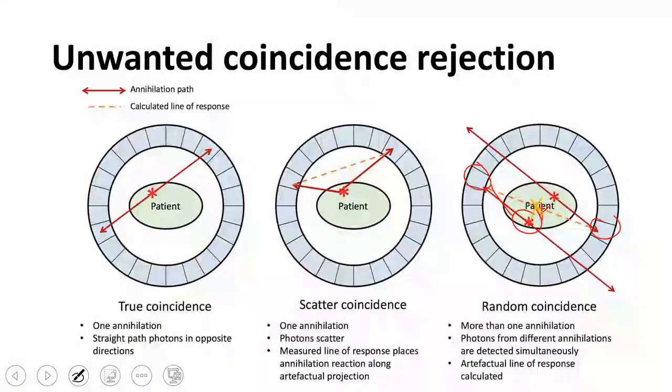The true event, which is the first one, is the true coincidence. There is something called a single event. What does single event mean? It means a detector receives a photon, but the detector that is supposed to receive the other one does not. So, I call this a single.